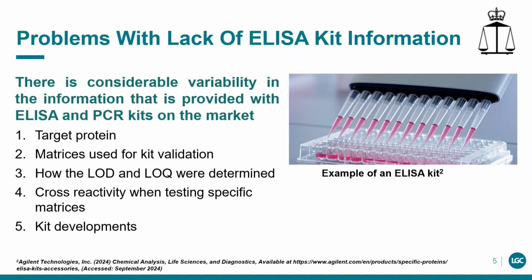Similarly, some kits give information about cross-reactivity when testing specific matrices, and others don't. This issue is exacerbated by kits constantly undergoing development, frequently under the same name, yet details about any changes are not always available.